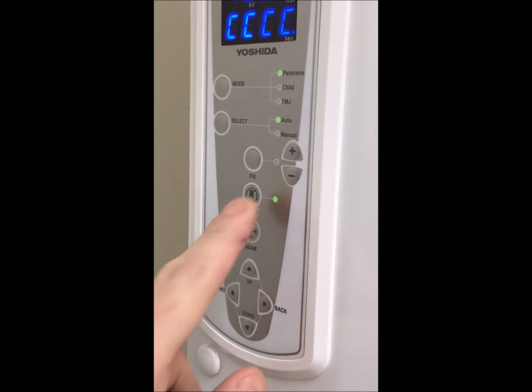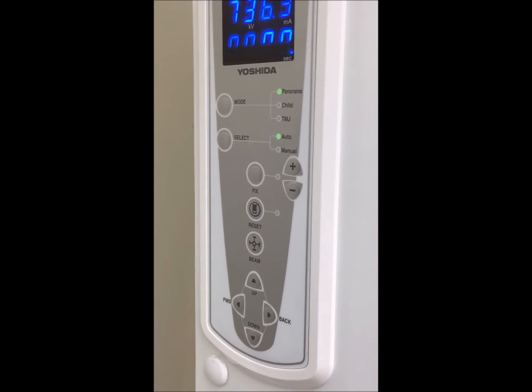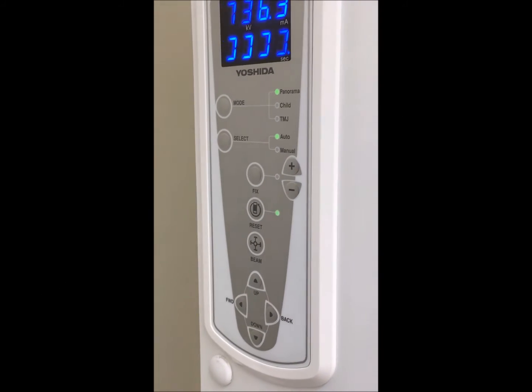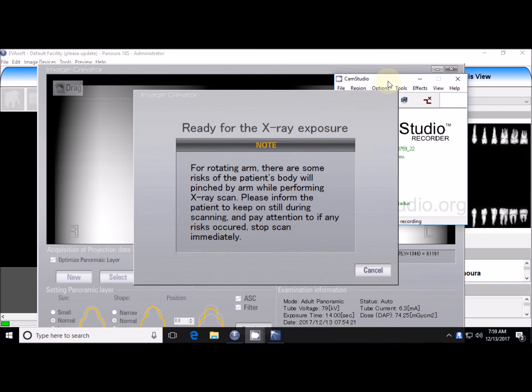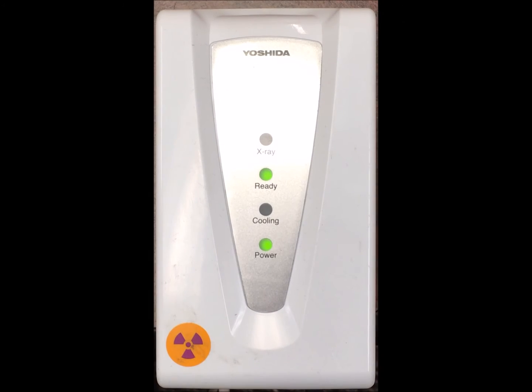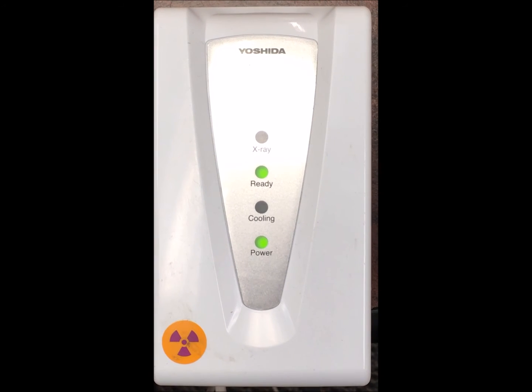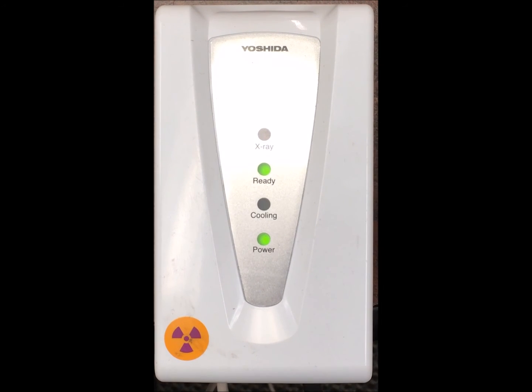Once the patient is positioned, press reset on the console and then confirm on the computer screen that the exposure screen still appears. Go out of the room and look at the hand switch and confirm that the ready LED is solid green and it's not blinking.